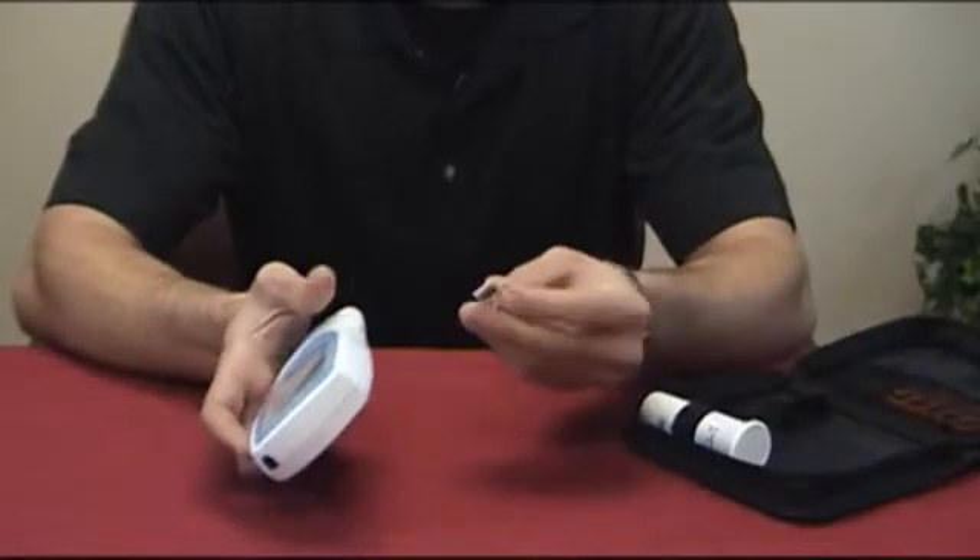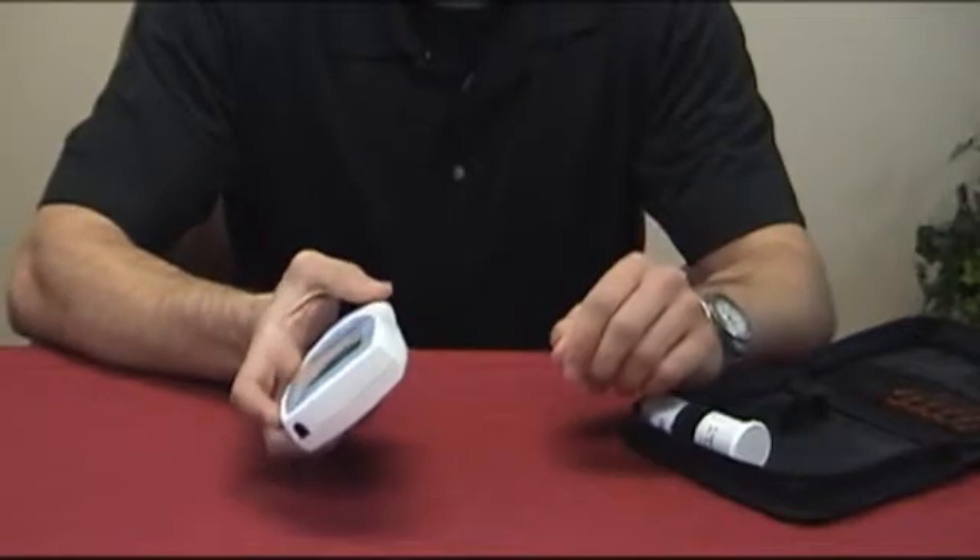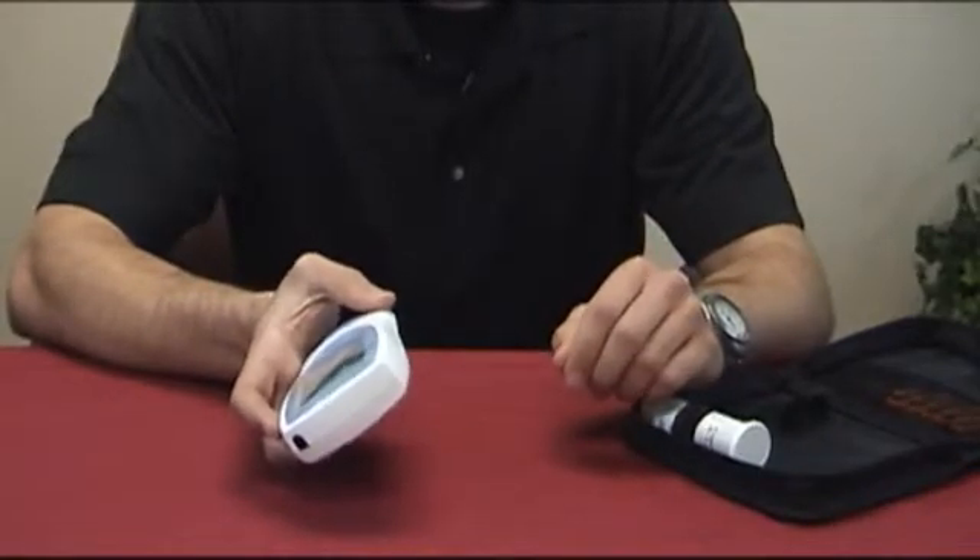First, take the code chip out of the box and insert it into the left side of the meter. Be sure to remove the old code chip and insert the new one.